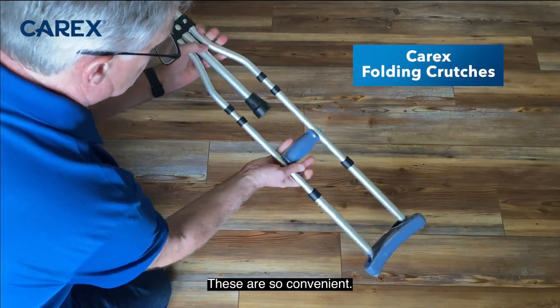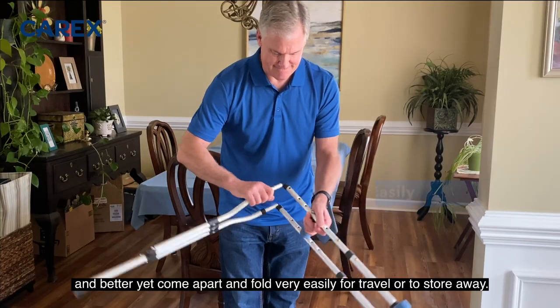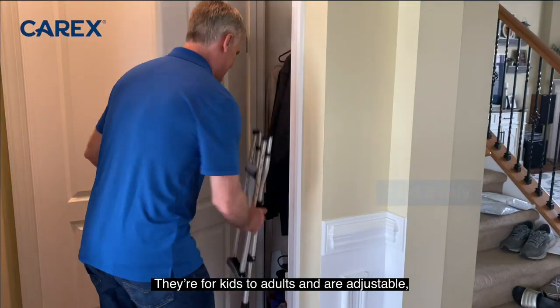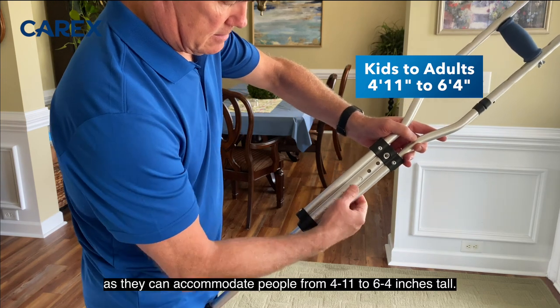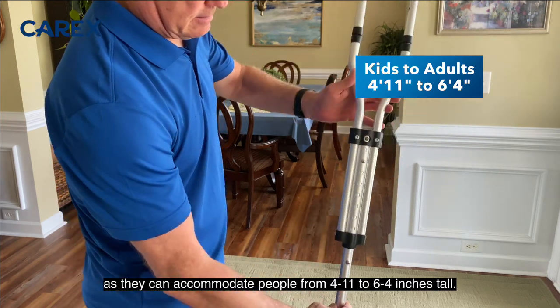These are so convenient. They're super simple to put together, and better yet they come apart and fold very easily for travel or to store away. They're for kids to adults and are adjustable, as they can accommodate people from 4'11" to 6'4" tall.